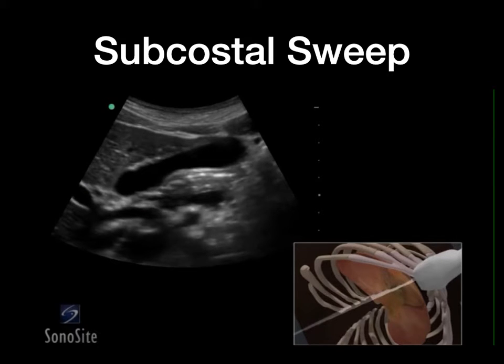In longitudinal, the gallbladder can be long and peanut-shaped, though there is a ton of variation in shape. Note here the presence of the exclamation point sign that the long gallbladder makes with the portal vein.